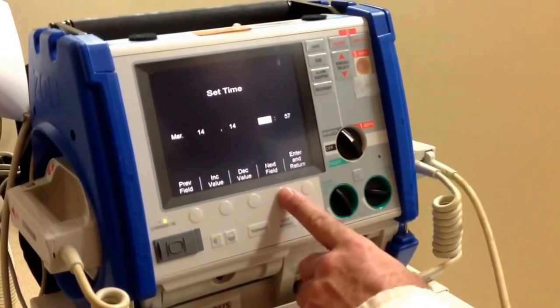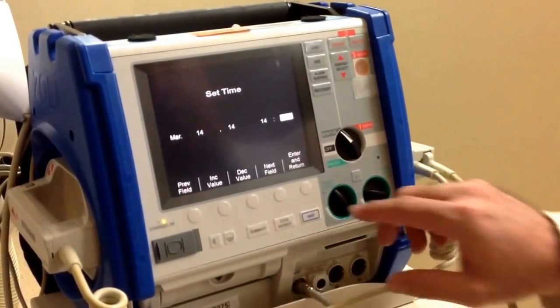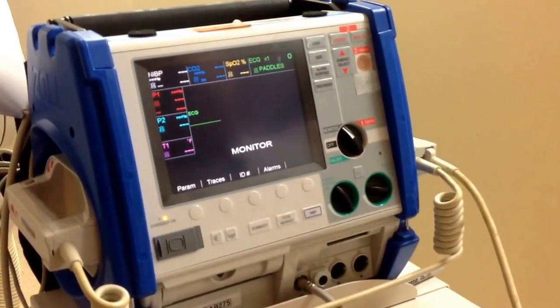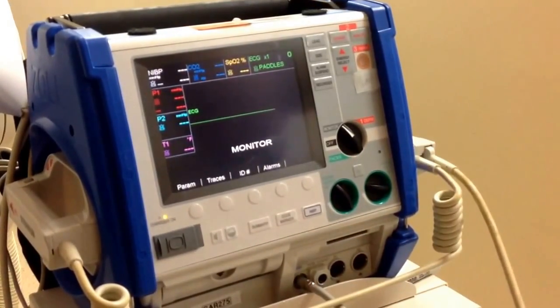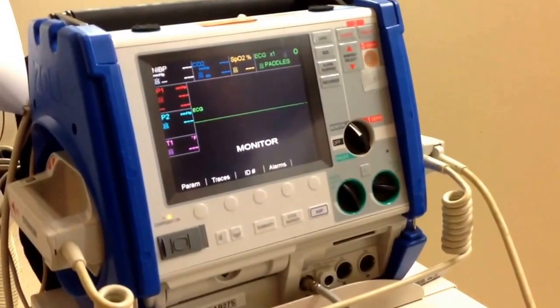Scroll to the minutes by hitting the next field. When you have the proper time, press enter and return, and now you have set the correct time on the cardiac defibrillator monitor. Thank you.